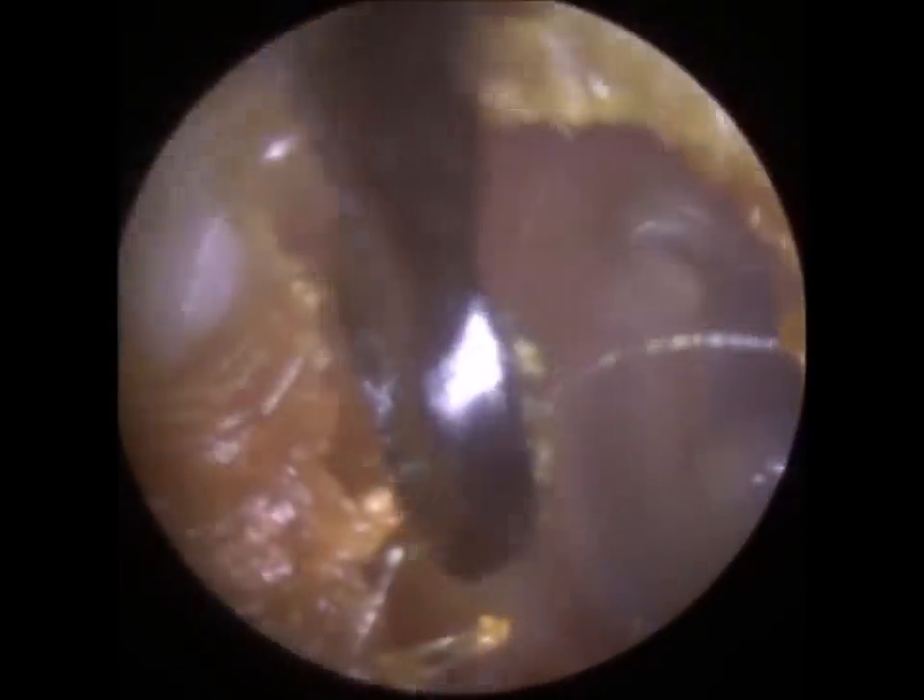So you may feel me against the canal wall, but we're nowhere near your ear drum. It may tickle a little bit. Is that uncomfortable? I'm not applying much pressure. Just a little bit — I'm sure it'll be alright. If it is uncomfortable, let me know. There's no other way of removing this wax and that's exactly what we have to do in the ear. That's fine.